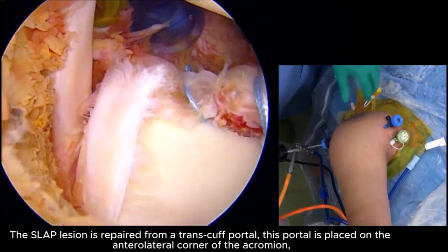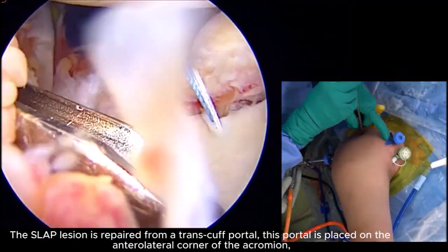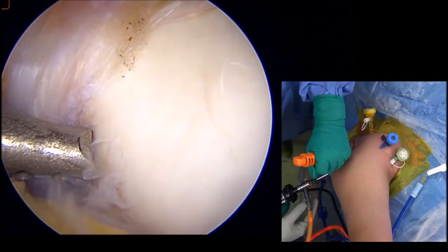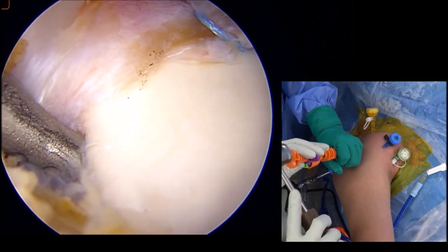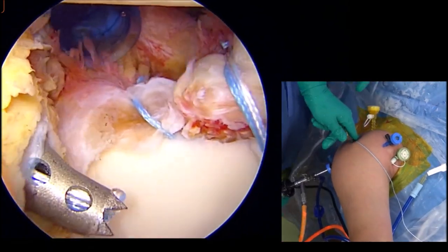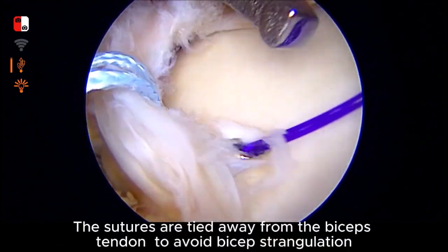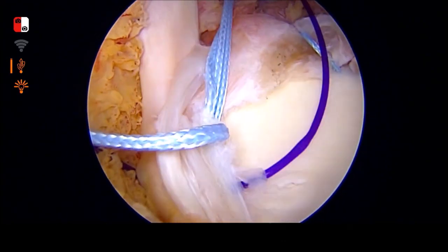The SLAP lesion is repaired from a trans-cuff portal. This portal is placed on the anterolateral corner of the acromion. We repair the SLAP tear at both anterior and posterior corners. The sutures are tied away from the biceps tendon so as to avoid biceps tendon strangulation.